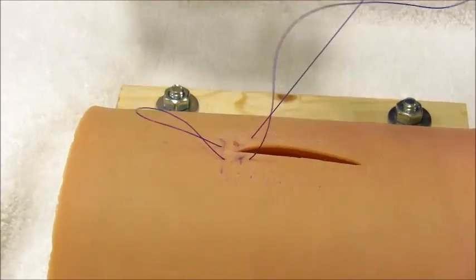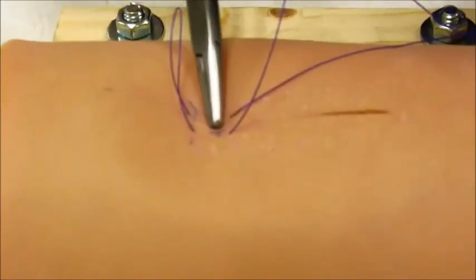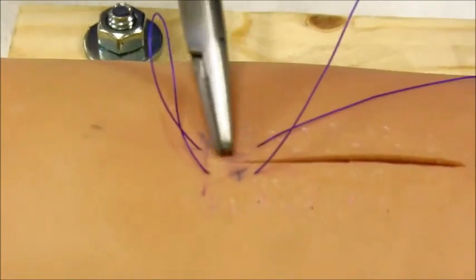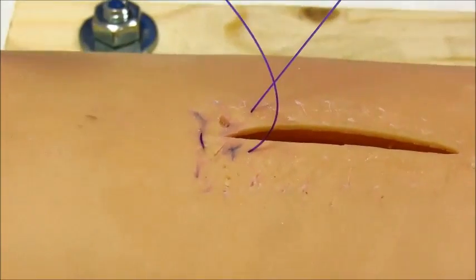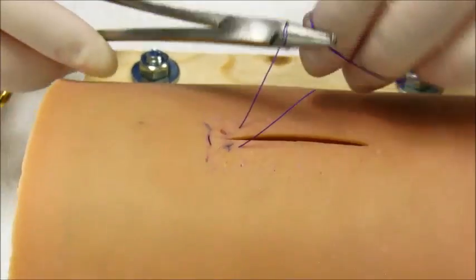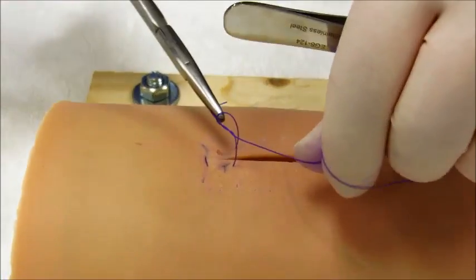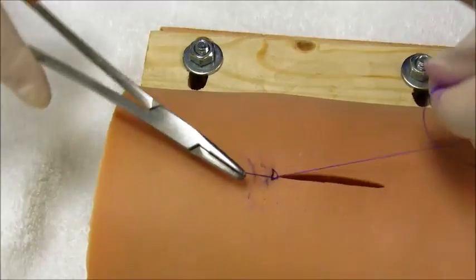So one important thing that you can do with this pattern, and you should do, is you can notice that my incision ends about right there, but my loop is past the incision. So it's important to over-sew or let this part on the one side of the incision become buried as well, because the goal of these patterns is to create a very watertight seal. And then similar to when you're burying the knot in the body wall, you're going to pull parallel to the incision to bury that knot as best you can.